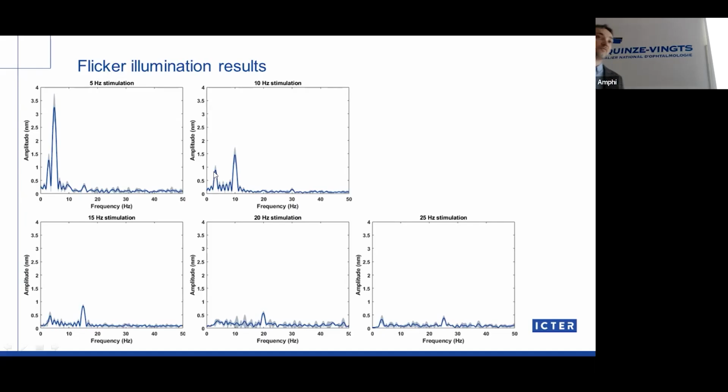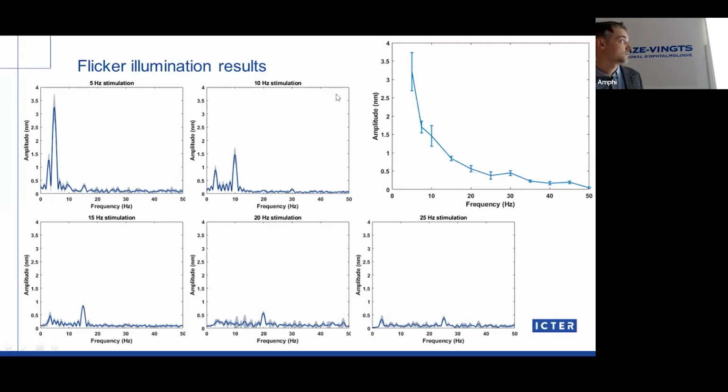Maybe as a curiosity, it was a very nice talk. I saw that your precision is almost nanometer. Can you comment on it? Yeah, we were considering that and thinking about it, and in the paper we actually calculated, and it's approximately as it is here. But the reason is because here we average the signal also from the multiple pixels. When we try to do this with this patterned one, the signal gets worse. And the other thing is that we also use this Fourier transform, so we have a lot of volumes from which we compute the spectrum. So it nicely uniformly propagates across the high frequencies.